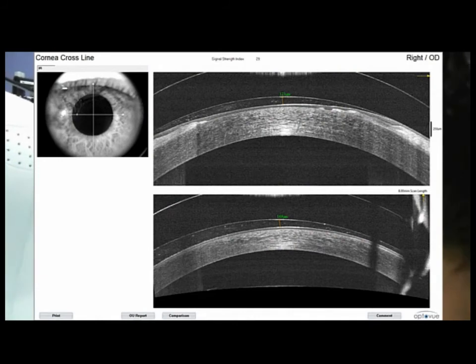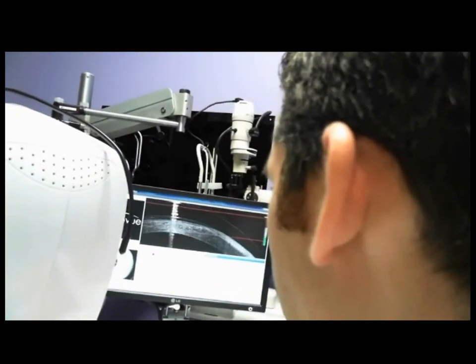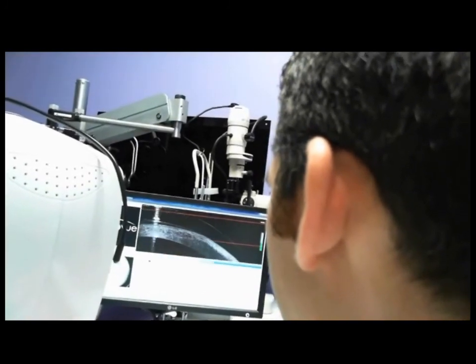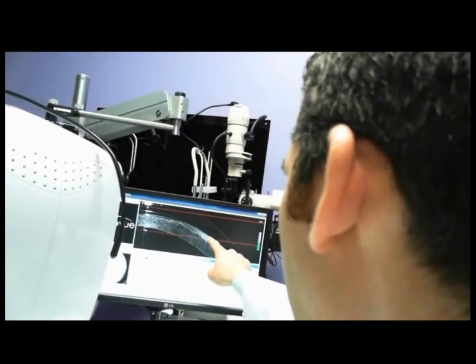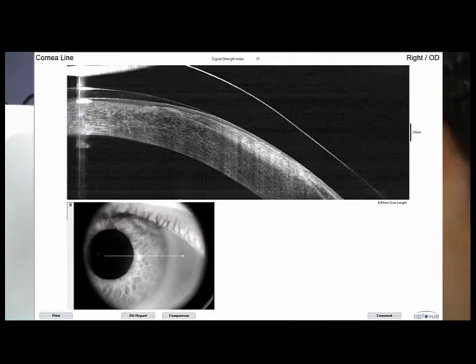This is a cross scan, which shows us a vertical slice and a horizontal slice. And now we're going to take a line scan, and we're going to look directly through the pupil on that nasal portion. And you can see right here, we are still bearing right on that nasal cornea.